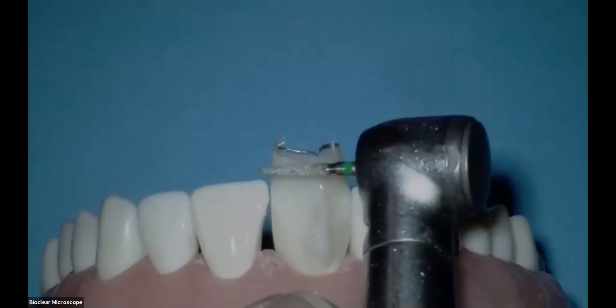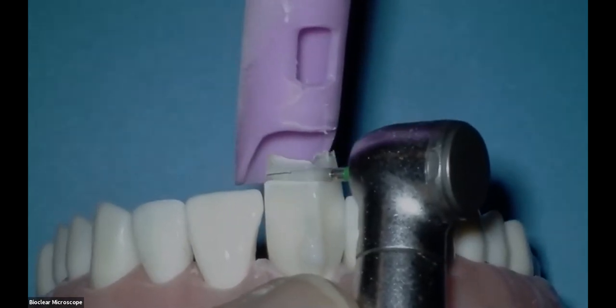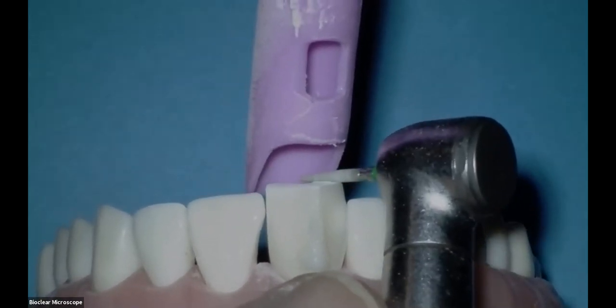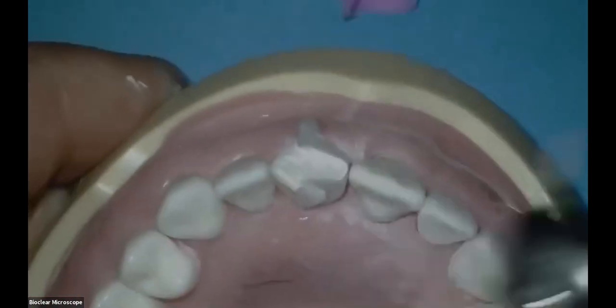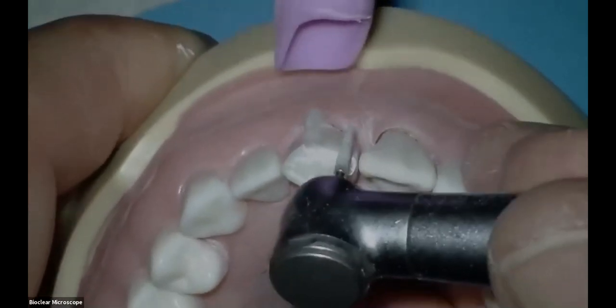We're going to cut exactly 1 millimeter from the incisal edge. Go. And then we come along here. We're going to cut about 1.5 millimeters from the tooth because we're going to veneer over the tooth.